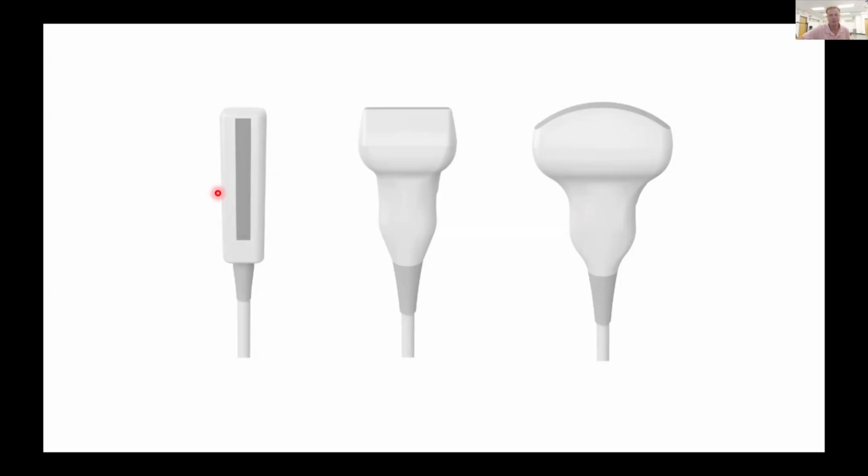Instead, we use this flatter form factor on the left, which actually allows us to strap the probe to the patient. And these flat probes were originally designed for veterinary purposes, but are now fairly extensively used in the musculoskeletal biomechanics space.